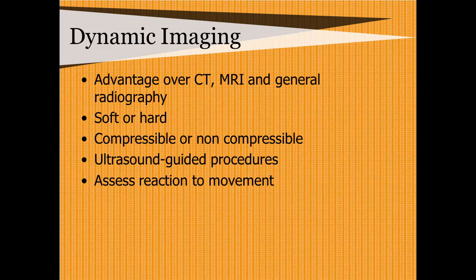So next we're going to talk about dynamic imaging. And that's a big advantage that we have again over conventional imaging, such as general X-ray or CT or MR. So we don't see necessarily globally like they would, but our advantage is we can look at something dynamically.